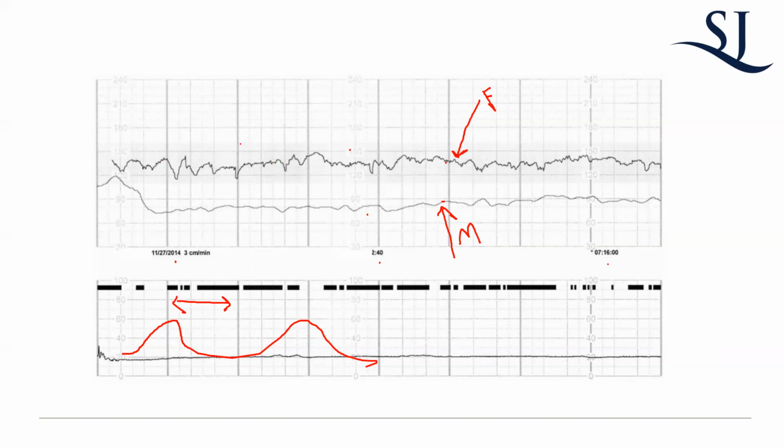For a fetus, you want variability in the fetal heart rate. So basically you want it to look kind of squiggly, all right? That's not really so with a maternal pulse. You may have some variation, but you may not. It kind of doesn't matter. If you think of yourself, is your heart rate really going so erratic? Not really. So each one of these boxes is about a minute.